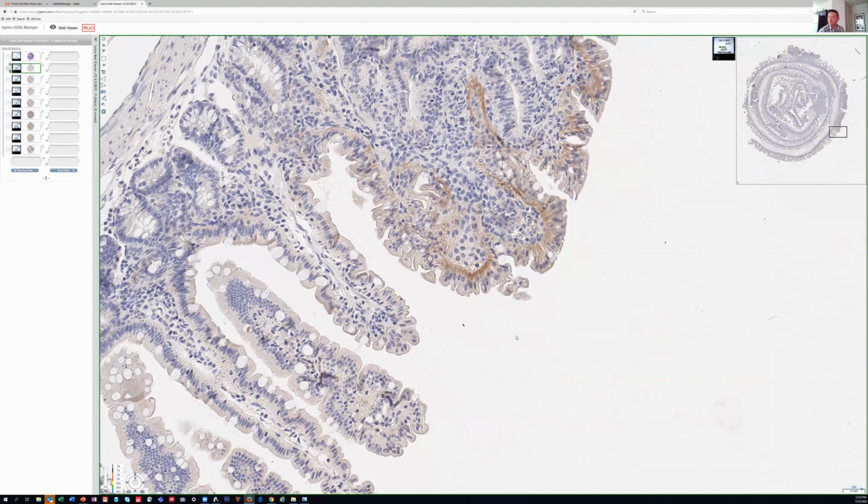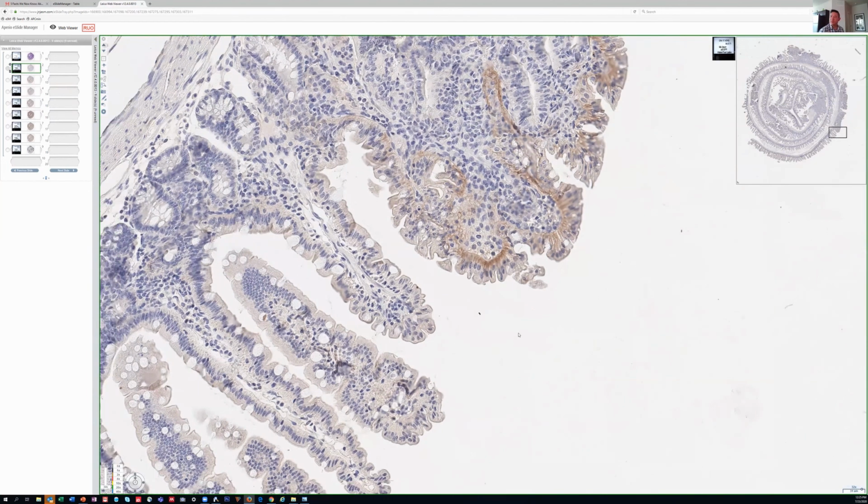But yeah, it looks like the activator is more basolateral rather than apical, in terms of the polarization, which might actually make sense if there's something that Wnt activation induces, signaling to EGFR from the adenoma out, on the bottom side. Hard to know, but it does look like overall protein expression is clearly enhanced. That looked like a pretty slam dunk. And I certainly would think that would be possible.